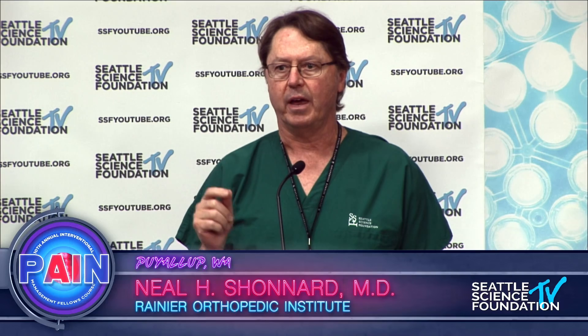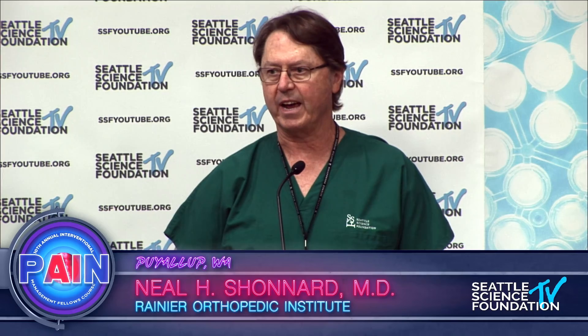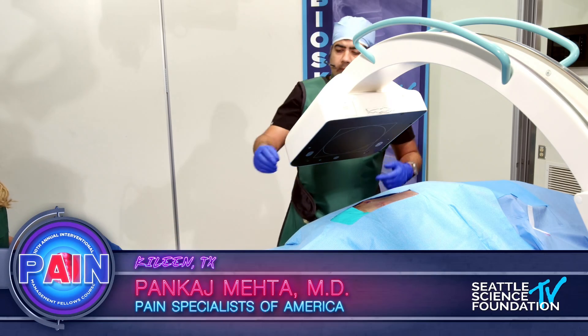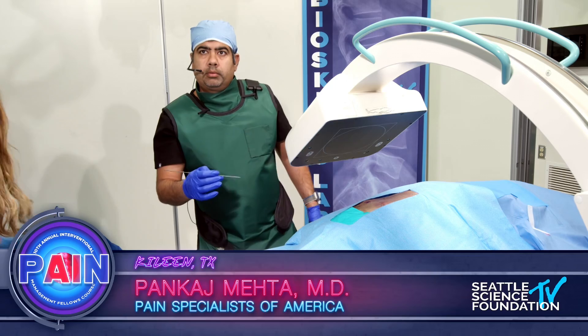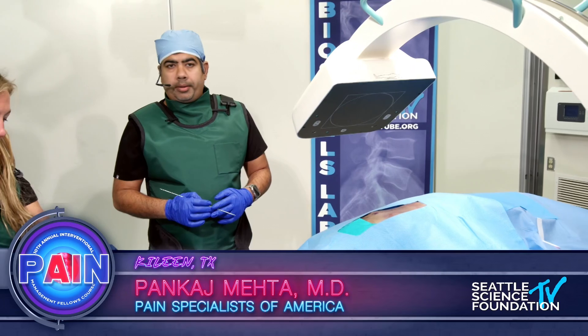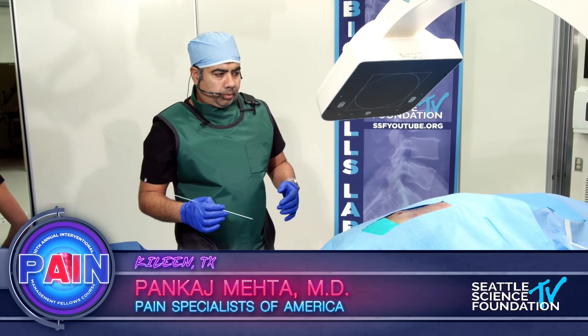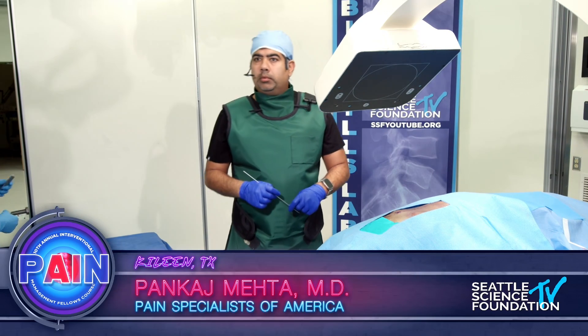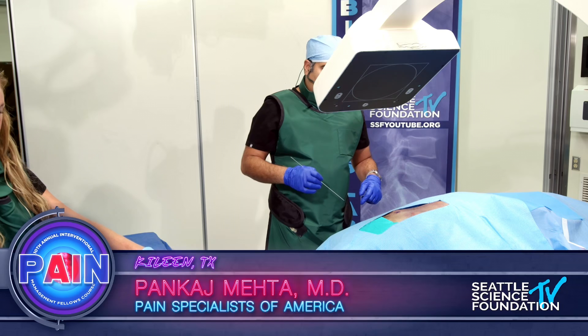When you're looking at these devices and you get in the lab, get your hands on each of the devices and get your feel for each of the cadavers, so that in your hands you see which of these techniques you're more comfortable with. Can you raise the X-ray? A key thing to recognize when you're doing these procedures is give yourself working room underneath the image intensifier — you need to have room to work. Go ahead, Pankaj.